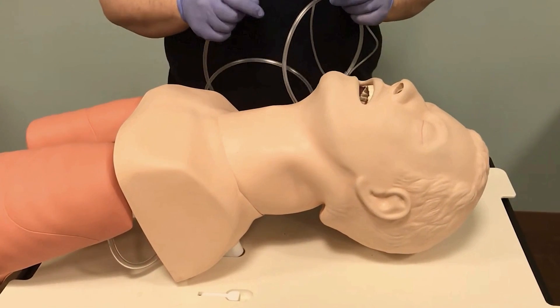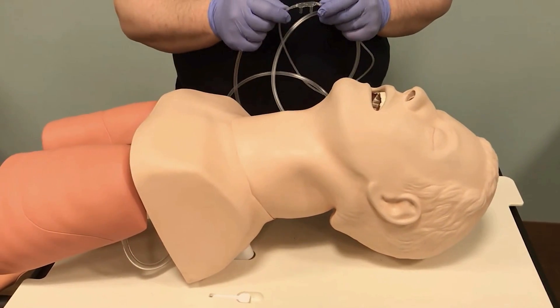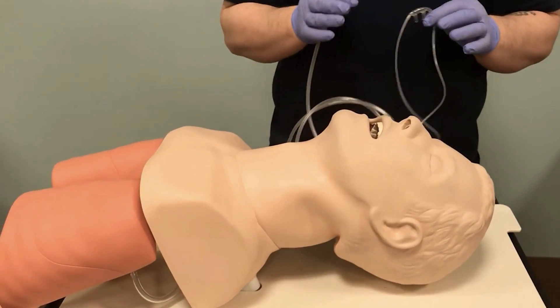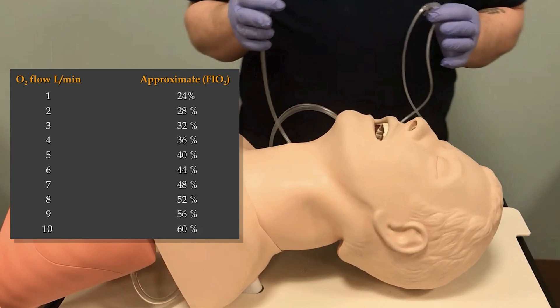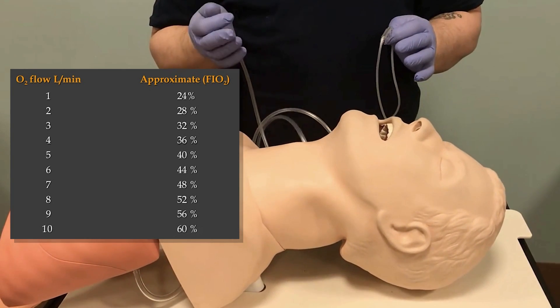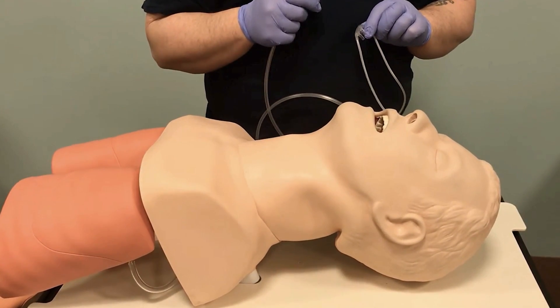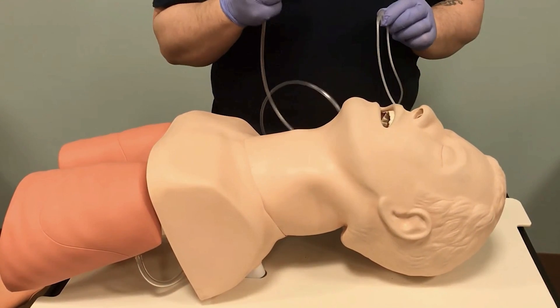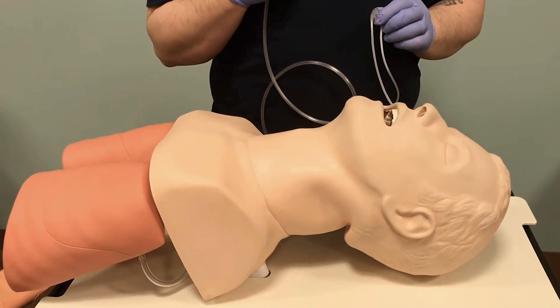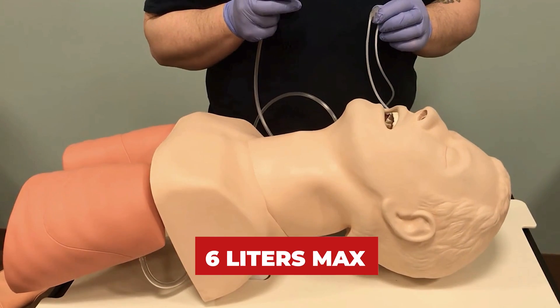When we look at our delivery devices, specifically the nasal cannula, we have an adult and a pediatric version. When looking at flow rates, we have a range of one to six liters. We max out at six because we're delivering cold, dry medical-grade oxygen directly into the nares, which will dry out the nostrils and be very uncomfortable — so we cap it at six liters.